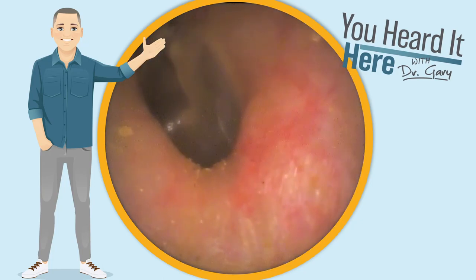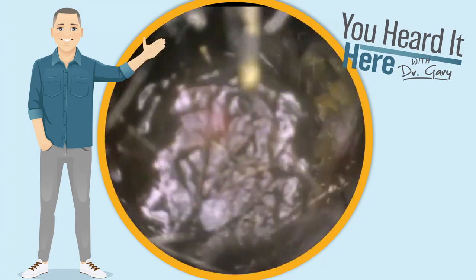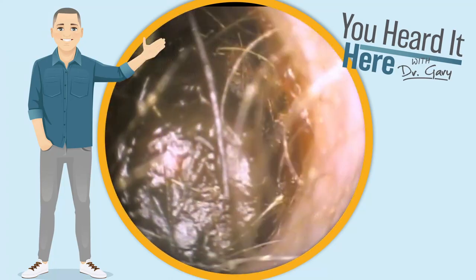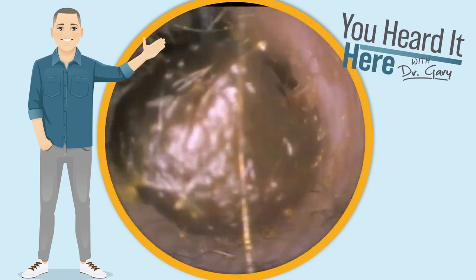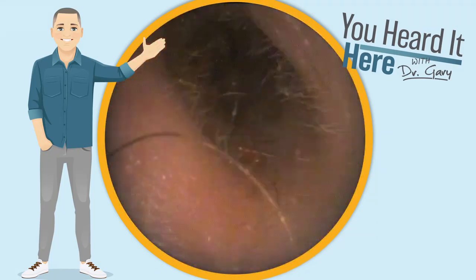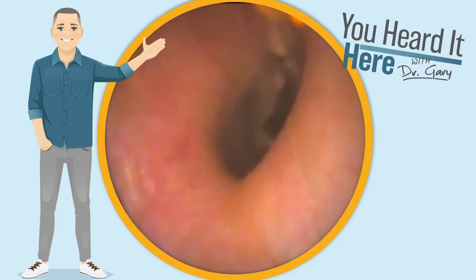We can use the curette to remove one big chunk and get a clear view of the eardrum. Moving on to the other side, we see wax of similar coloring and consistency. Let's see if we can move it all out in a big chunk again. As you can see when we use the curette or the Jobson horn to push on the top of the wax, everything moves together. After removing that one big chunk, you can see again a clear view to the eardrum.